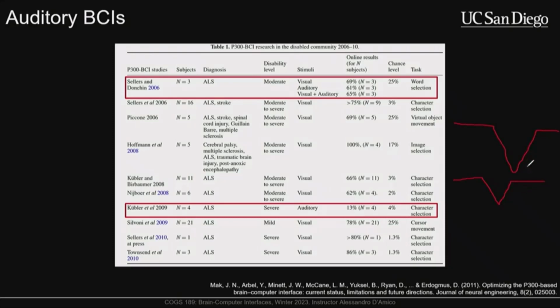Because you're getting this information summated in real time within the user's brain. This isn't even like an average that we're doing offline. These components are going to be averaged by the time they get to our electrodes. The individual components might actually get attenuated. Now, if you had the opposite, like if I took this auditory stream and pushed it over by like 100 milliseconds, then you would have this additive property instead of this destructive property, where the signals actually end up combining. They might sum up and make a much larger signal that's easier to discriminate. But it depends on the context.